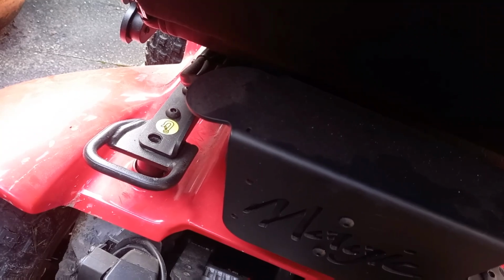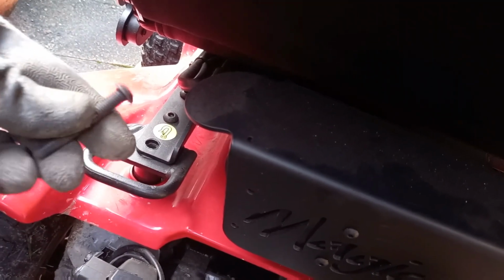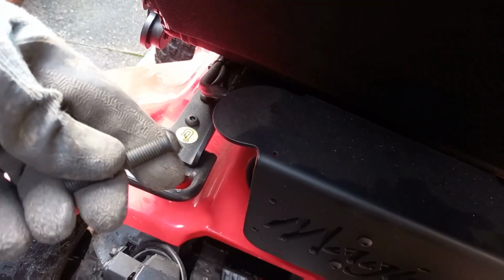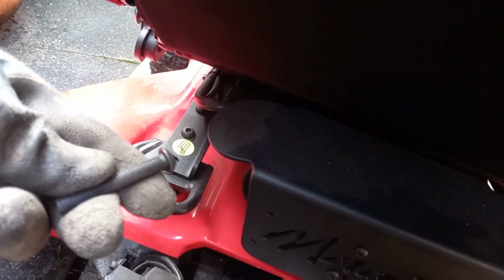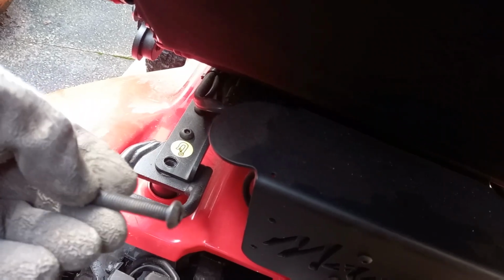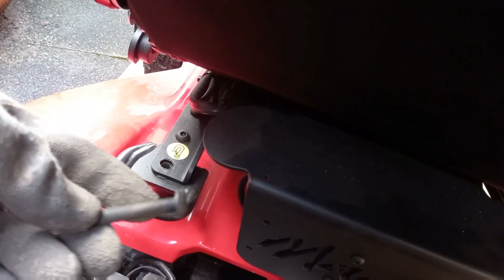Well, I'm only saying it would have been good practice for them to have washers, or even, instead of using bolts like that, which, to be honest, are rubbish. So are you listening then, Magic Mobility? They should be using a flanged head, zinc plated fastener, really, because that'll just go rusty and corrode. It's just dipped in oil or something. It's your engineering background, pedantic coming to the fore.